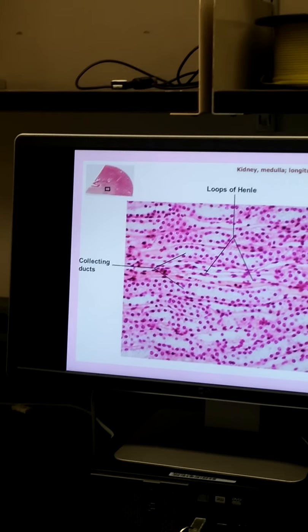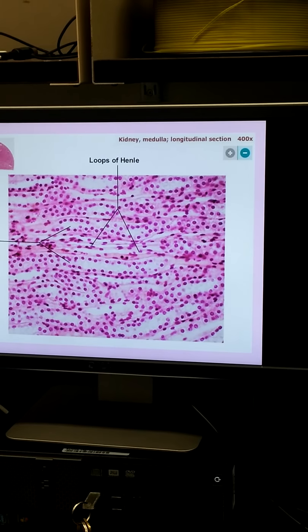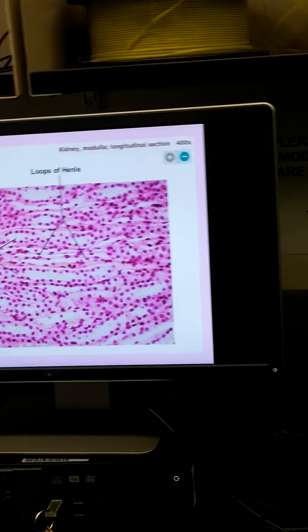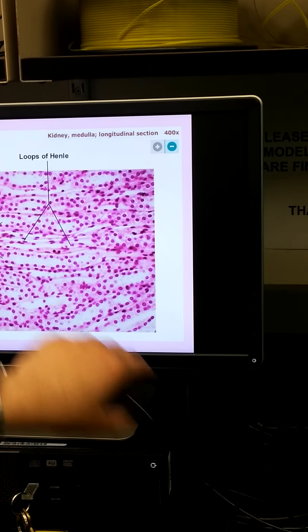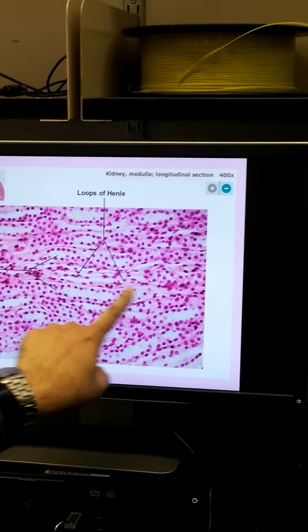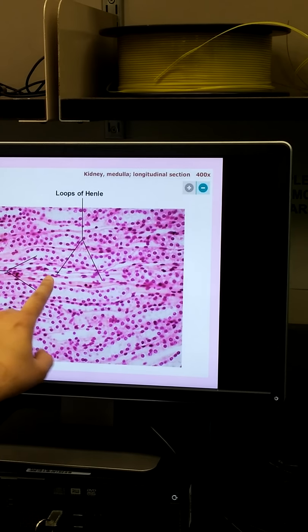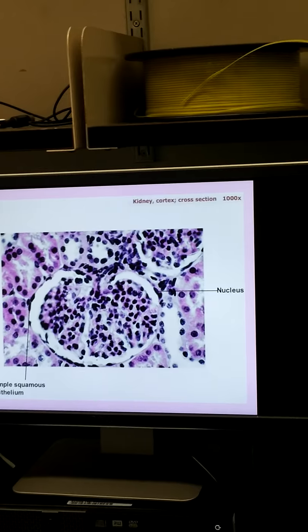The capillaries, though, they're not that visible. So I wouldn't exactly say that's a capillary. In this one, not really, no. I expect you to just distinguish between the light pink, and know that loops of Henle are present. Because you see those capillaries. But it will be hard for you to pick the capillary out in this. That I give you.